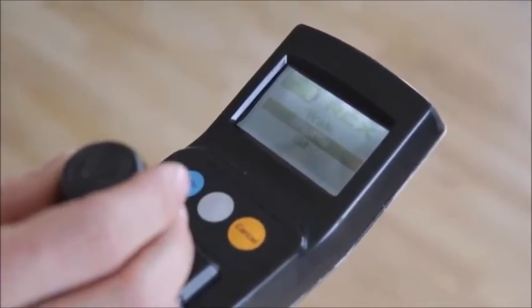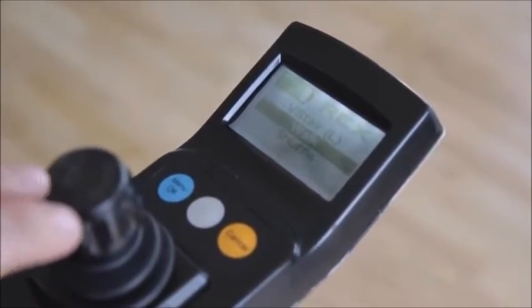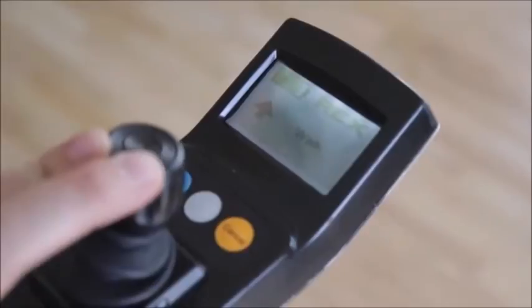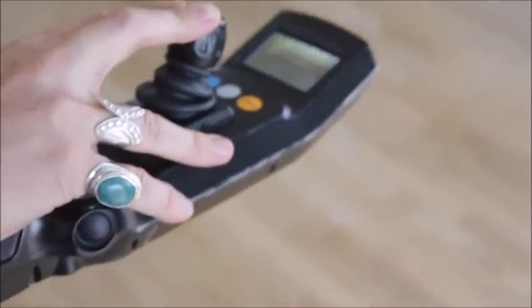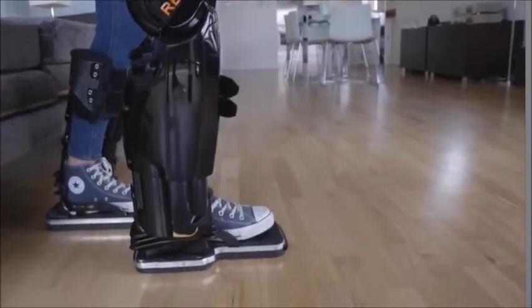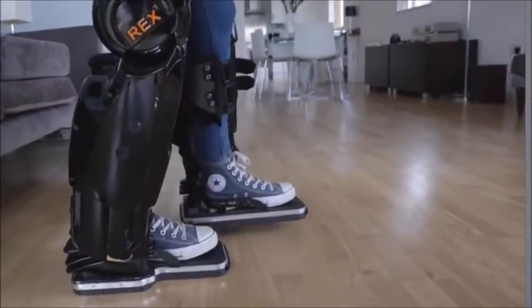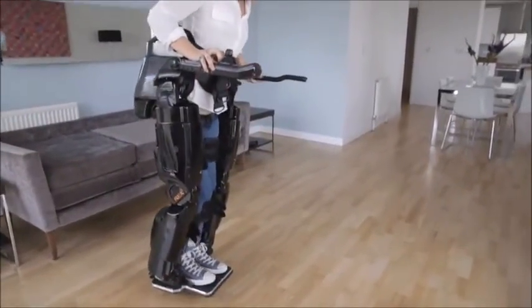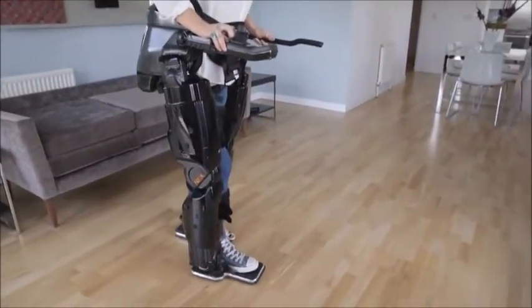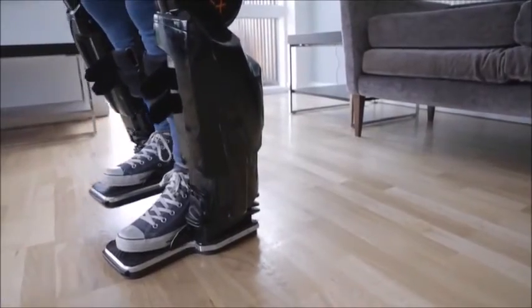There are a number of different functions that Rex can carry out. Let's start with the walking. By simply selecting walk from the list of programmed actions, I can begin to move forwards or backwards. With a walking pace reduced to a third of a typical walking speed, the stability is increased and I feel more secure and safe. We have found, and I agree, that most people certainly don't want to go any faster than this.